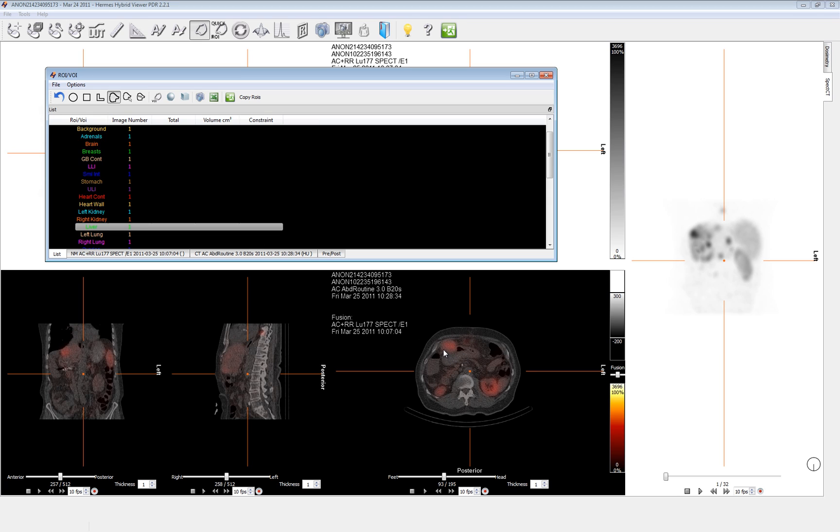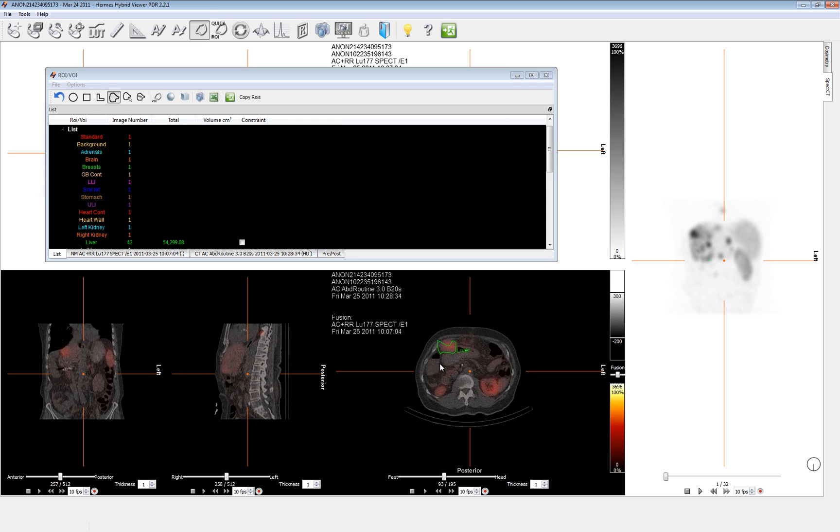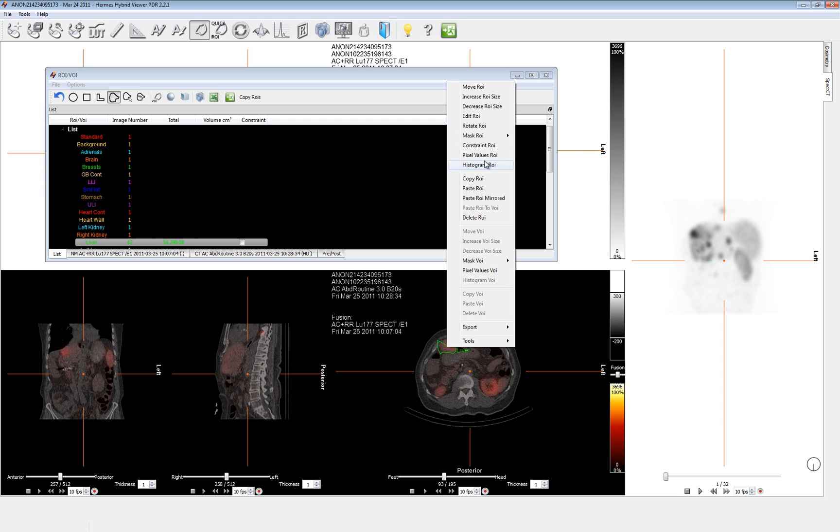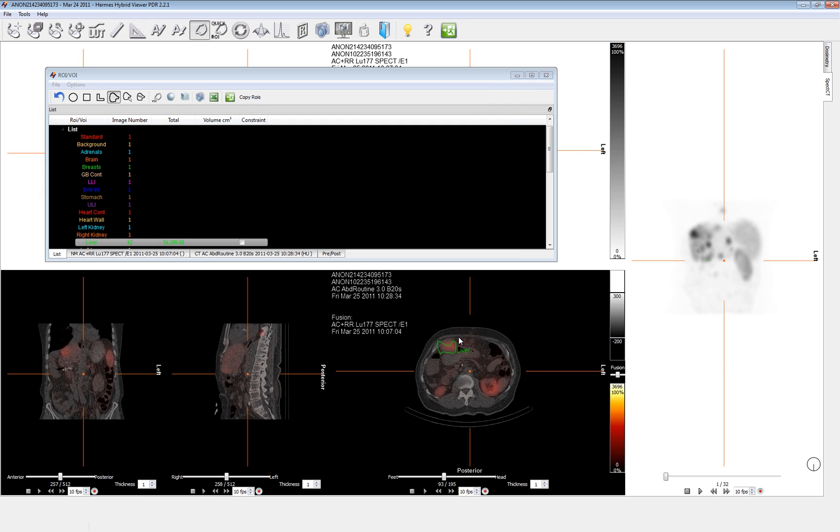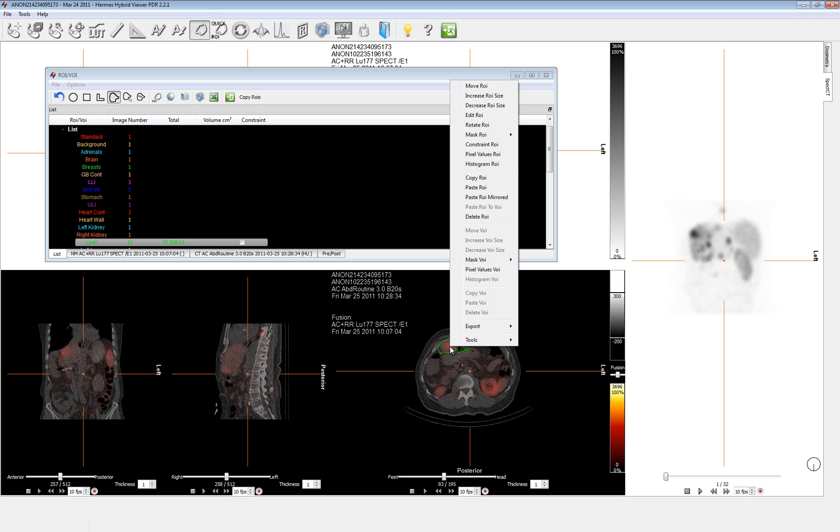From the list we'll choose what we're going to draw and in this case I'm choosing the liver. I'll do this on the SPECT CT fused and there's just a little chunk of liver here. Now if we make a mistake as I will leave a huge chunk of liver out here, we have options to edit the ROI and we can just kind of pick it up at some point, finish off the liver as we wanted, and let go, and it fixes that so it's a very nice tool.